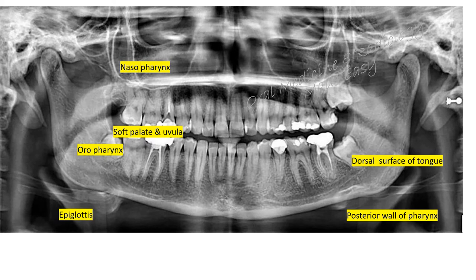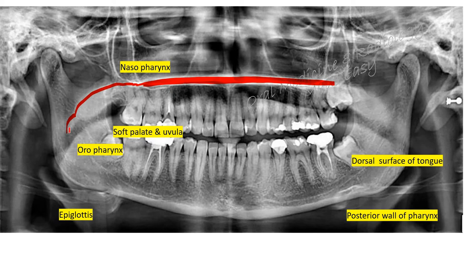This radiopaque structure seen here is the hard palate. The hard palate ends posteriorly as the soft palate, which then has a small extended structure called the uvula. This is the soft palate and this is the uvula. Here also you can trace the soft palate and uvula.